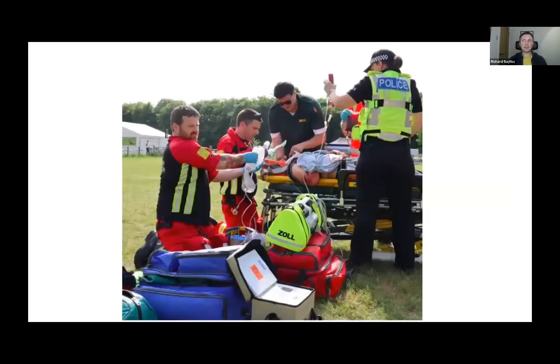We've already discussed some of the benefits from an anatomical point of view, to improve our chances of getting a good laryngoscopy view and reducing the risk of unrecognised esophageal intubation. But there are other benefits from the use of videolaryngoscopes. You can have shared situational awareness between the anaesthetic team, that might be between the anaesthetic assistant and the airway operator, or between the airway operator and supervisor. So it allows a supervisor to provide guidance to a more junior colleague or reassure themselves that all is well.